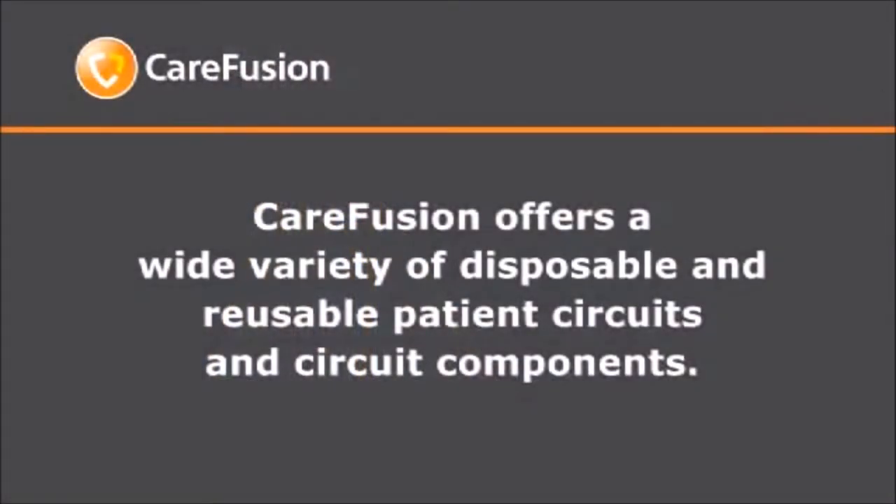To complete attachment of the patient circuit to the ventilator, connect the end of the circuit to the 22 millimeter outlet port on the bottom of the right-hand side using the adapter. Slide on snugly. CareFusion offers a wide variety of disposable and reusable patient circuits and circuit components. Your home medical equipment supplier and clinician will assist you with circuit selection and ordering.